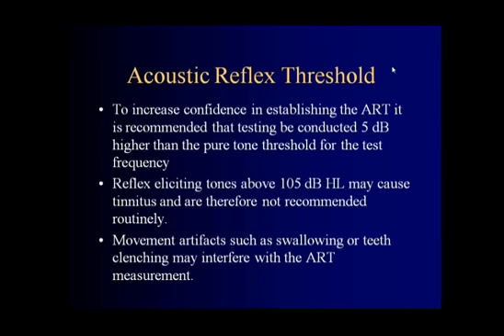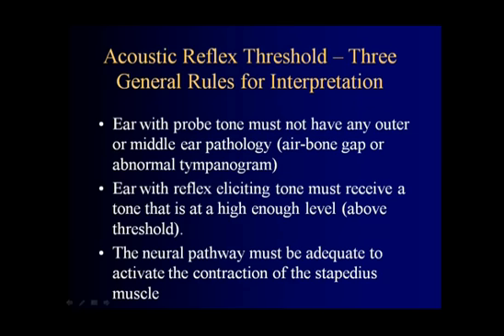Okay, acoustic reflex threshold. To increase confidence in establishing the acoustic reflex threshold, it is recommended that testing be conducted in 5 dB steps, starting 5 dB higher than the pure tone threshold for the test frequency. Reflex eliciting tones above 105 dB HL may cause tinnitus and are therefore not recommended routinely. Movement artifacts such as swallowing or teeth clenching may interfere with the acoustic reflex threshold measurements.